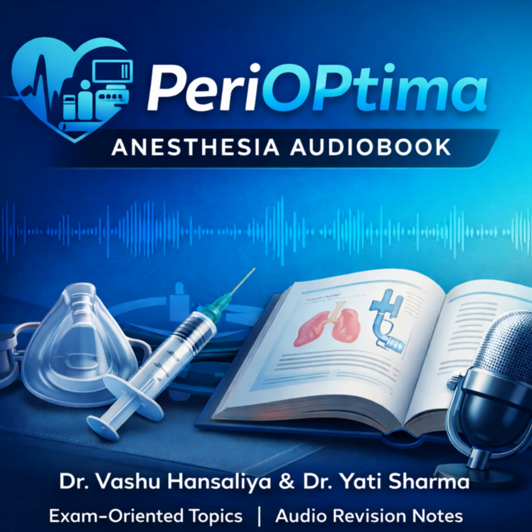While the first-generation devices remain crucial for spontaneous ventilation and primary rescue, the development of second-generation SGADs, with their improved seal pressures and the essential gastric drainage channel, continues to expand their utility into more complex surgical scenarios. Mastery of their specific design features, appropriate clinical application, and stringent limits is paramount for achieving safe and patient-centered anesthesia practice.